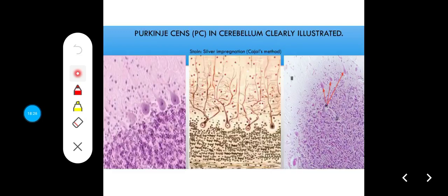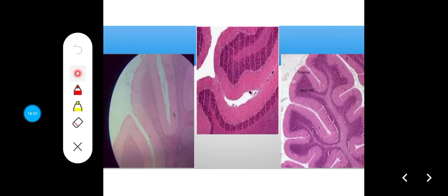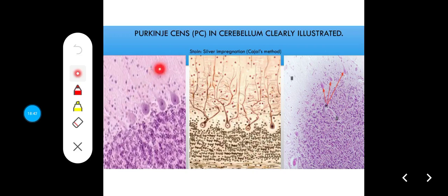Okay, now this is the cerebellum zoomed in. So this pale staining area, just like we've seen, is the molecular layer. The molecular layer contains few cells, so it doesn't stain much. What gives histology images a thick staining structure is majorly the presence of nuclei.